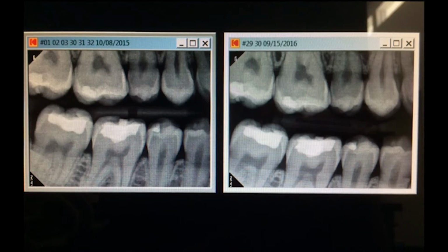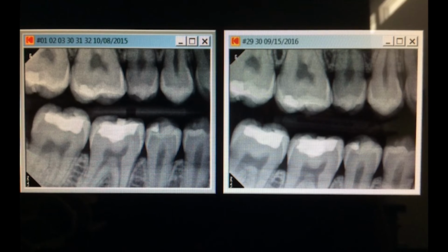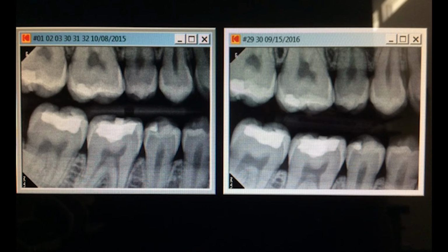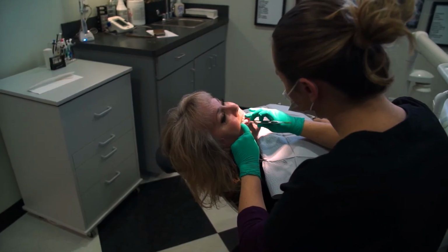At the end of a re-care appointment, I can look at those areas on the x-ray, point them out to the patient, point them out to doctor, and we can treat them before the patient leaves at the end of their 60-minute hygiene appointment. I can place several quadrants in one visit.